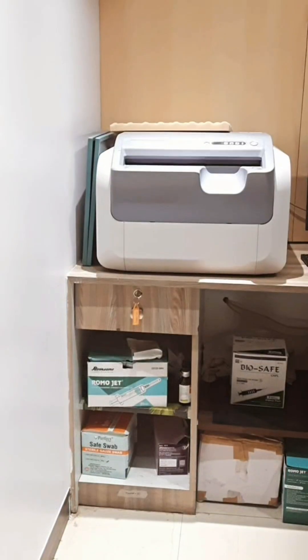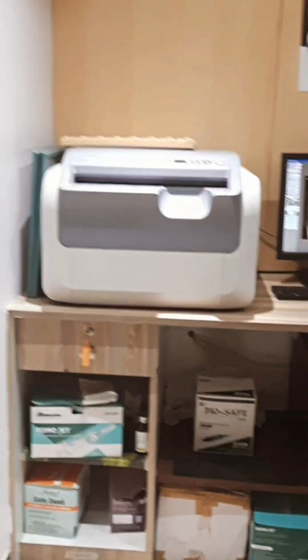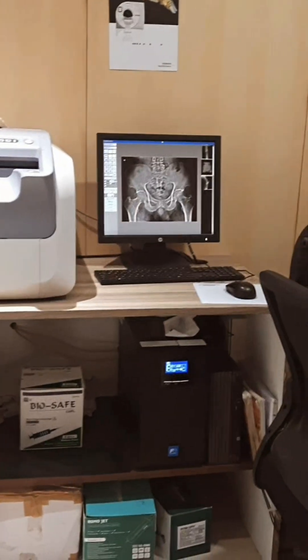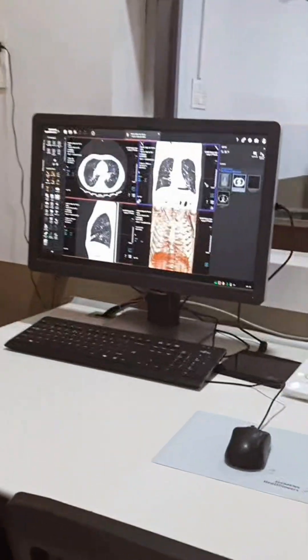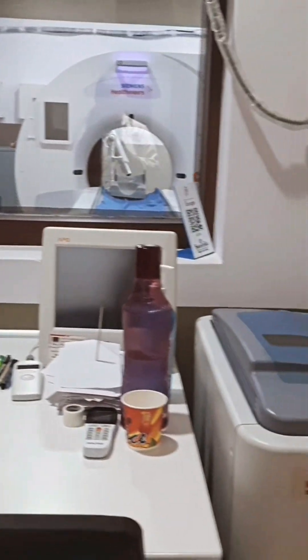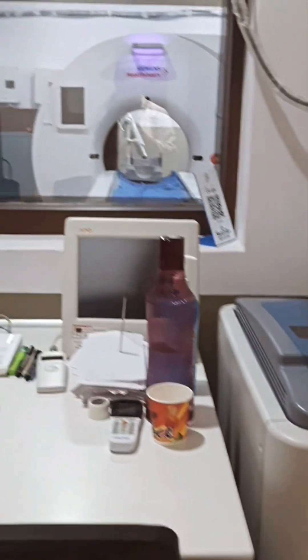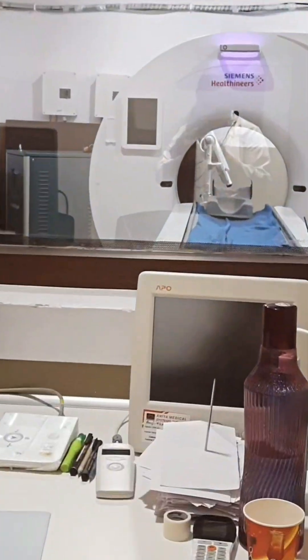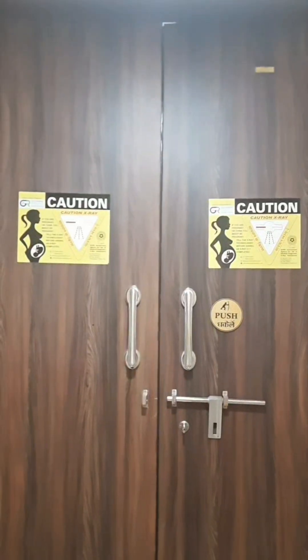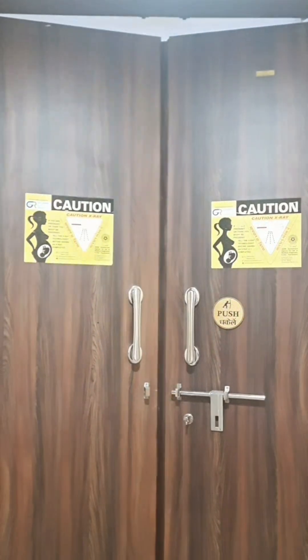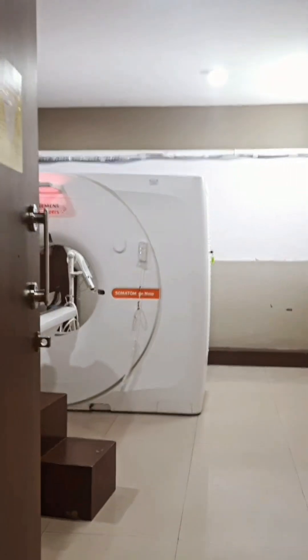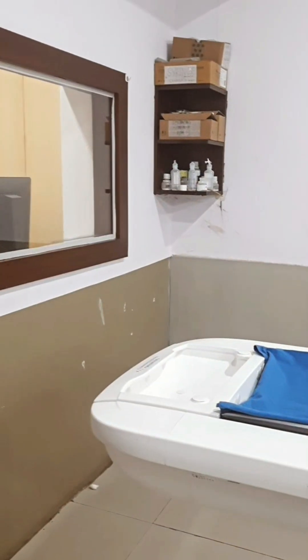This room is very important because from here we control the entire CT scan process. We select the scanning protocols based on the types of study the doctor has requested, like brain, chest, abdomen or bones. We adjust important settings such as slice thickness, scanning speed and radiation dose to make sure we get clear and useful images while keeping the patient safe. Patient safety, image quality and comfort are our top priorities here.